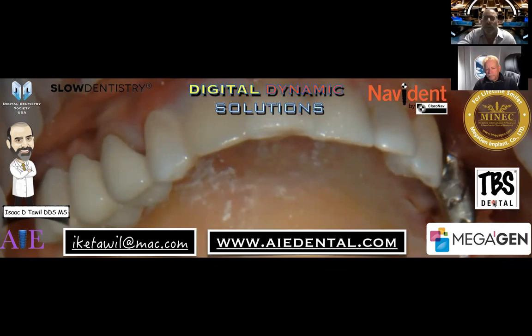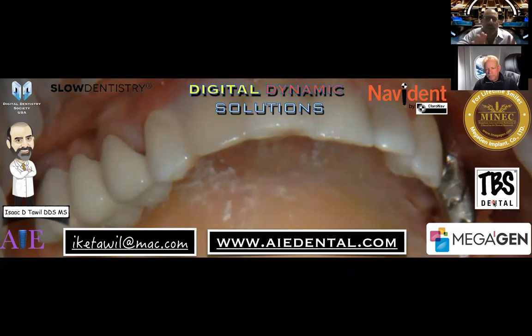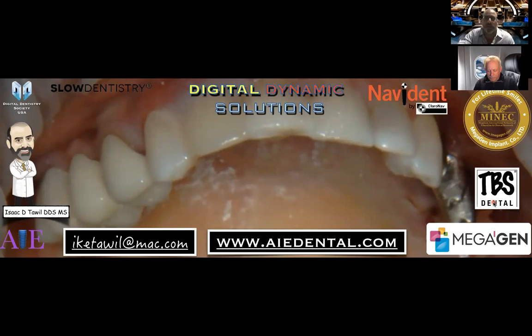If you want to use xenograft as an additive, I'm not saying not to. Certainly, you want to veneer the buccal after you've osteodensified a site, for an augmentation, or you want to add it into the sinus, there's no issue with that whatsoever.